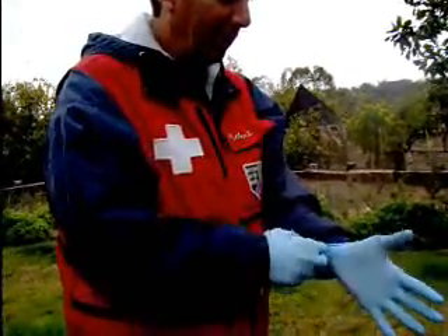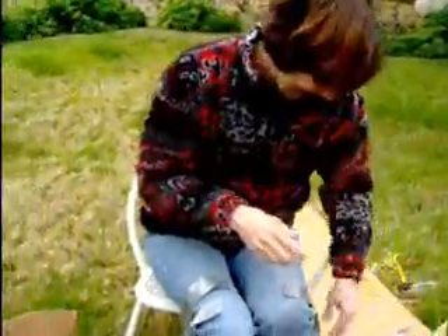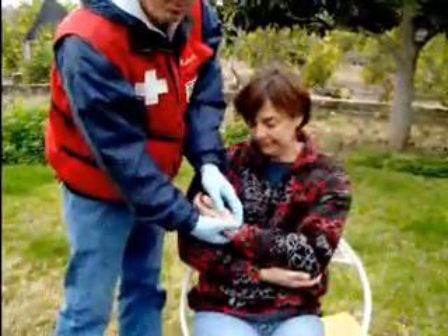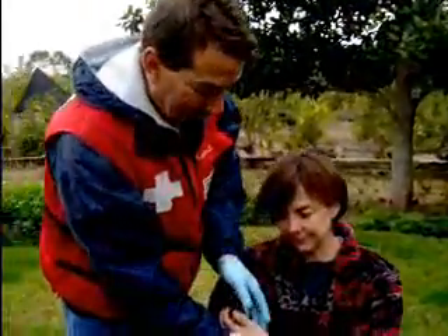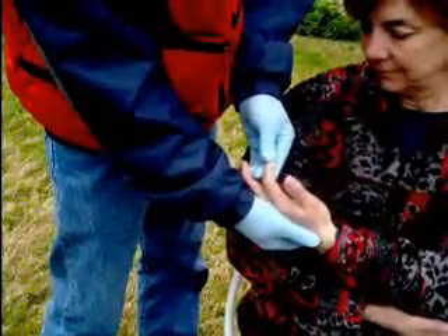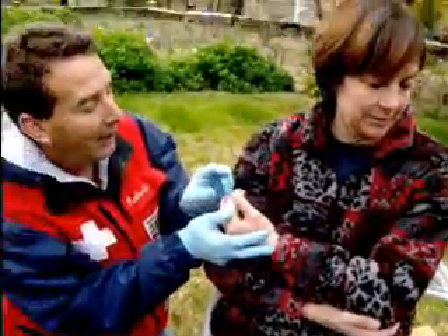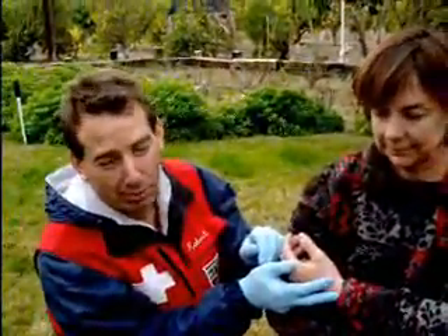So even though the patient here is unwrapping the duct tape to make it easy for me, I'm going to go in and try to pick up a pulse, verify that I have a pulse. Other options are I can look at cap refill, which should refill in two seconds, but you have to remember in a cold environment that may or may not work. I'm going to ask her, which finger am I touching? — Ring finger. — Yes, and can you move your fingers for me? — Yeah. — So I've verified that she has CMS prior to splinting.